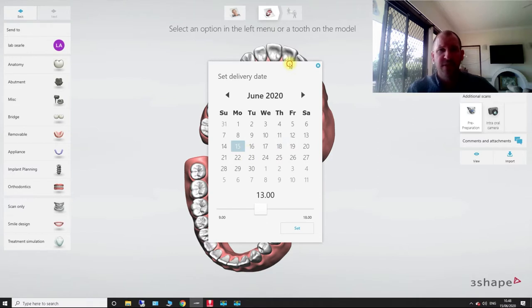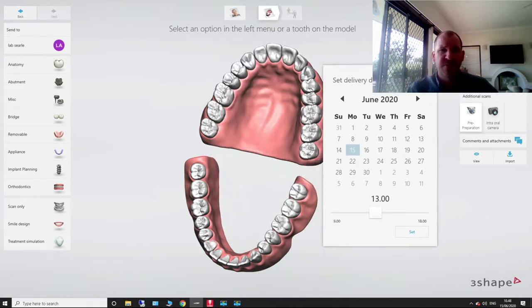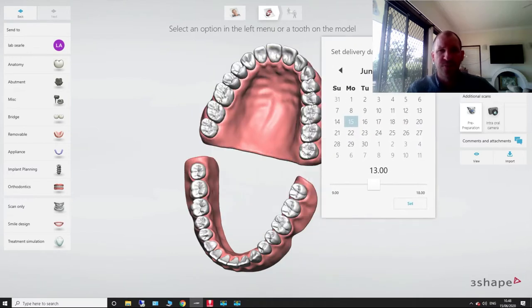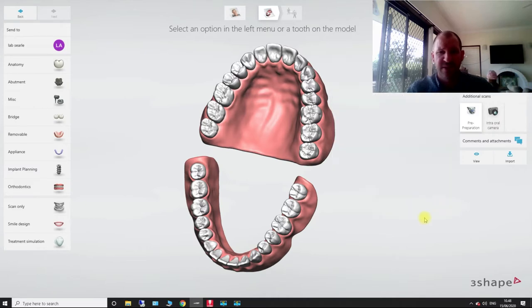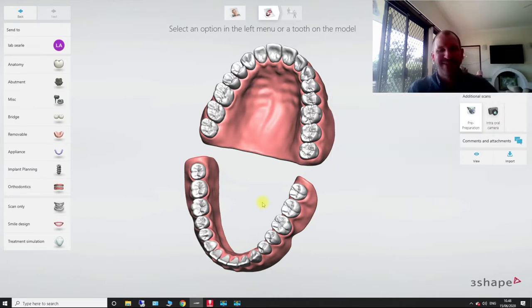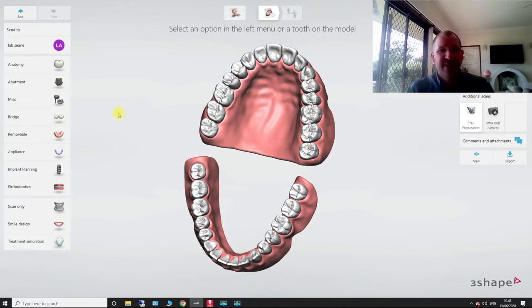So first thing you do, you come into your order form here, we'll set our date, so we'll set the delivery date, hit set. Sorry about my daughter.